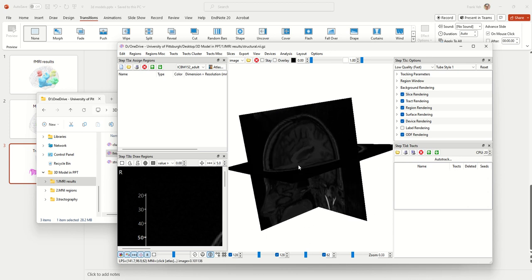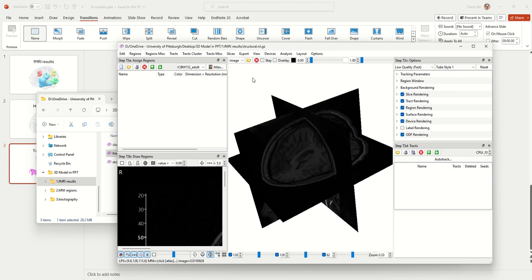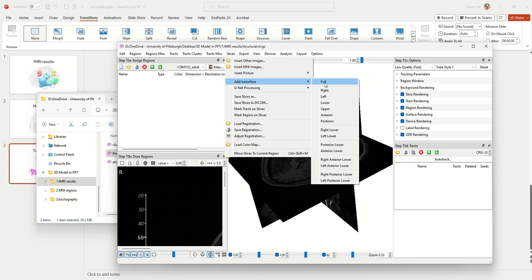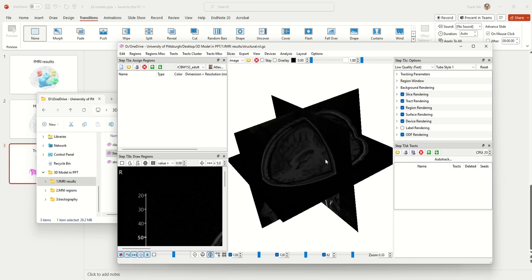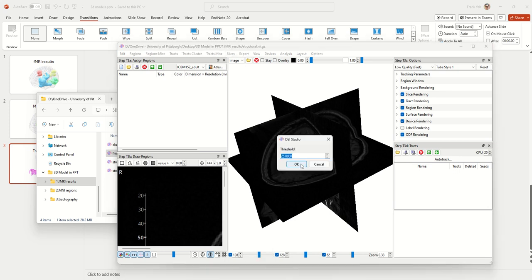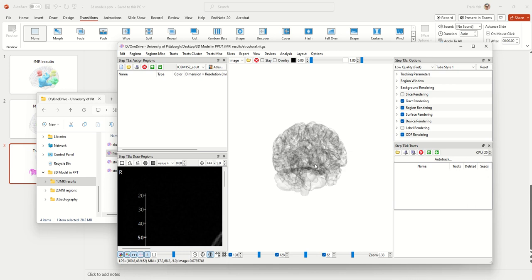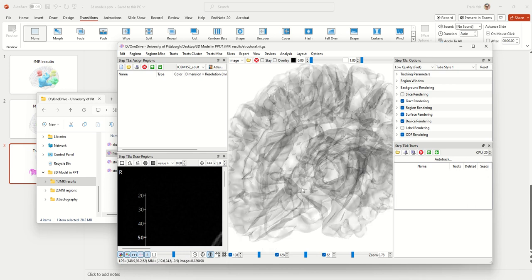The first step is to create a brain surface so we can look at the structure of the brain. To create a brain surface, go to the Slices menu, select Add ISO Surface, and click the entire brain. It will take a while — DSI Studio runs nonlinear registration to get a contour of the surface. At the same time it generates some other files in the same folder that will make surface creation much faster next time. Click OK, and if you turn off the slices you can see the ISO surface created.